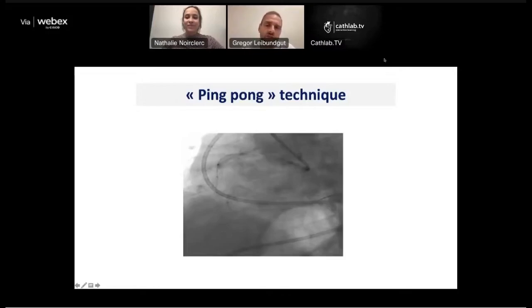In this case, you obviously lost a lot of time, and therefore you already had 200 cc of blood in the pericardium. Absolutely. This is the lesson for this case, unfortunately. Yeah, but you check the next 200 times. I call it the safety check. You deflate, you inject a little bit, and then you can safely retrieve the balloon, and you have all the time. And the 201st time, you don't do it, and then that's your next perforation. That's Murphy's Law. That's how it is.